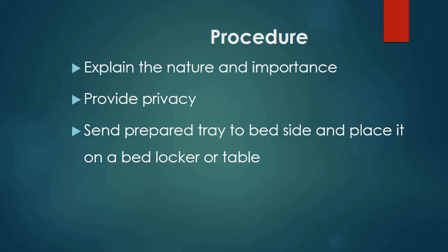So you assemble these items and send them to the patient's bedside and place it at a place that you can easily reach. The fact that I'm saying on the patient's locker or bedside table doesn't mean that they are the only items or the only places you can place the food. However, do not place the food on the patient's bed.